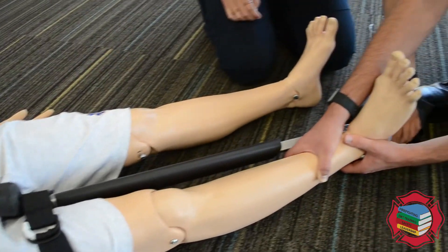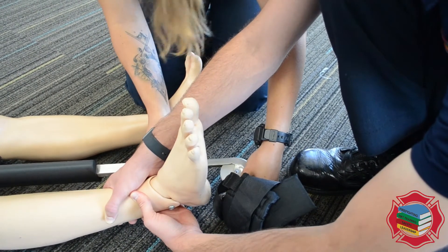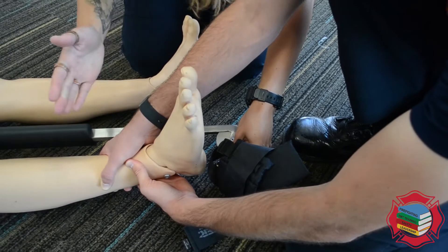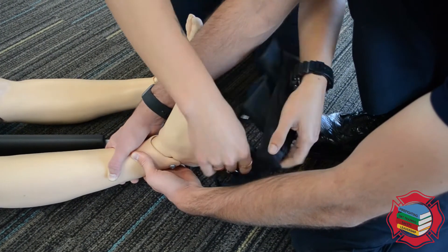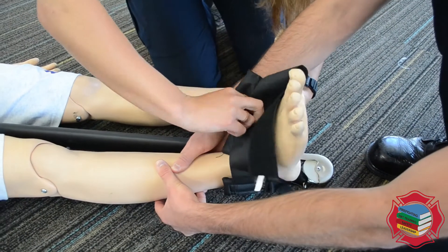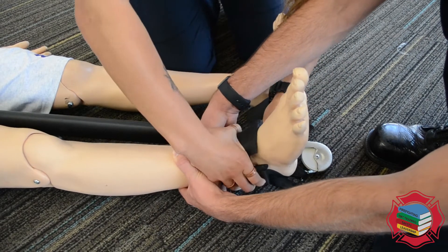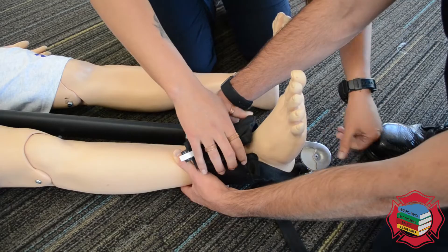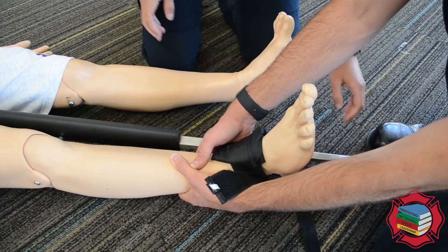Once you come down here, you're going to have this wheel. Once you attach the strap around the ankle, this wheel is going to be pulling pounds of traction. You're going to want to pull around 10% of the person's weight and do not exceed 15 pounds. You want this leg to come equal with the other leg and not past. While he's still holding traction — does not release traction — wrap this around the ankle. That pulls around the heel. We're going to pull traction here. That's equal; we're not exceeding 15 pounds.